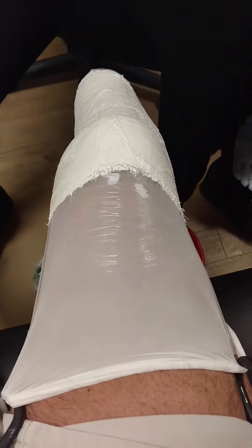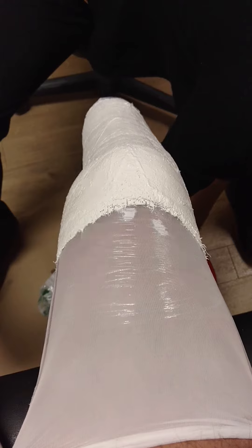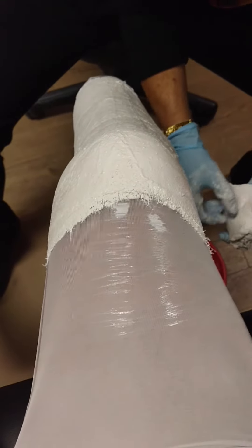This is all casting. He's got a lot of — a lot of what? So he's had some pain here, just the angulation. I had one fall — I fell in my bathroom.